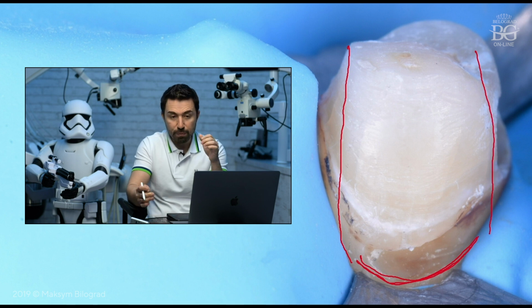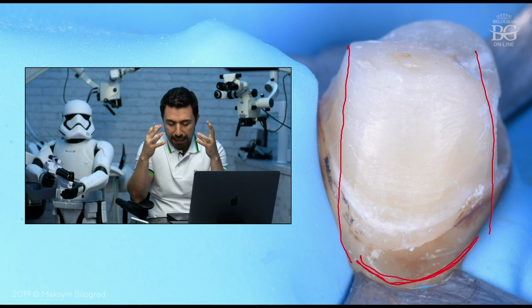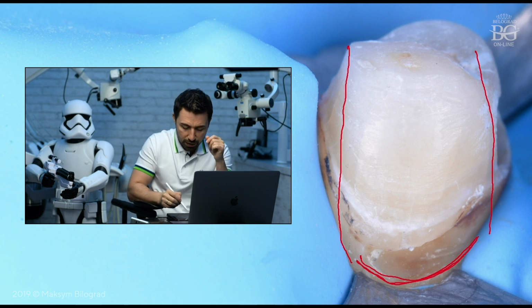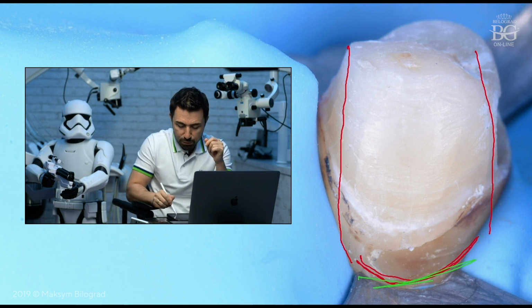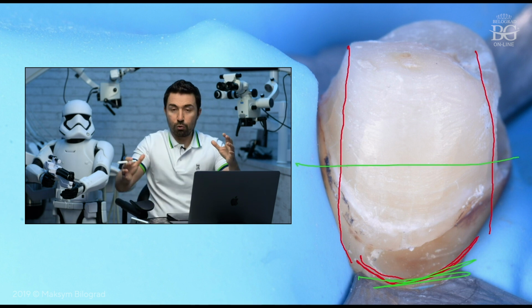I would also have to respect the tapered preparation, the conicity of the preparation, and I realized that the tooth in the area of the cervical lesion here is pretty thin, while here the tooth was pretty thick.